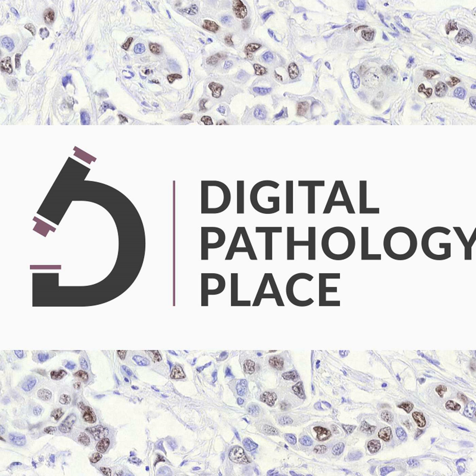And you had no way of checking it before purchasing. You can look at the block very rarely. Even if there were glass slides assigned to the block, there was not an option to actually view them before purchasing. Now in the biobanking space, the viewing of whole slide images of these specimens is a standard procedure. So if you use a biobank that doesn't do that, just find one that does, because then you can at least look at it and see what you're buying.